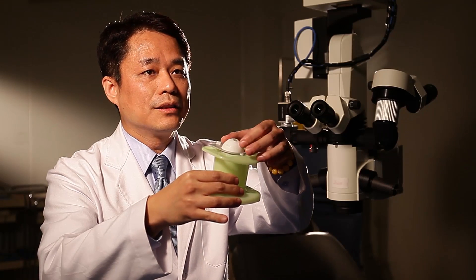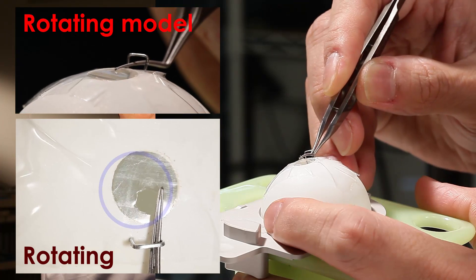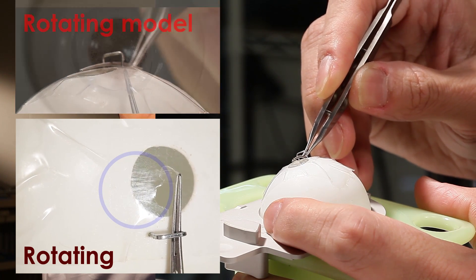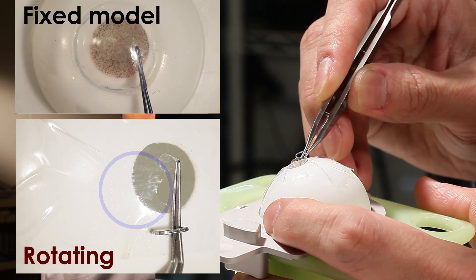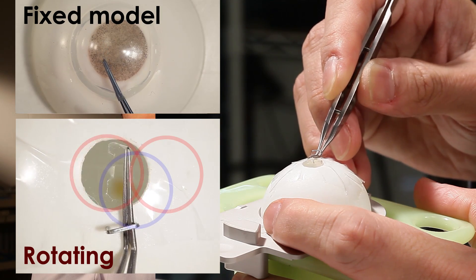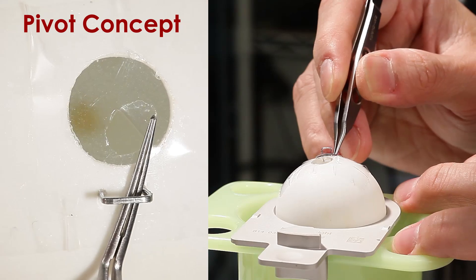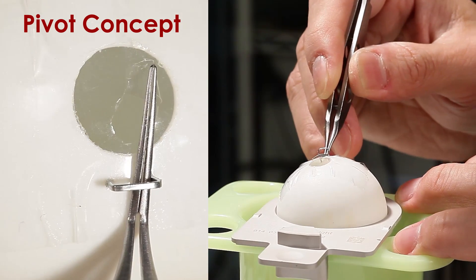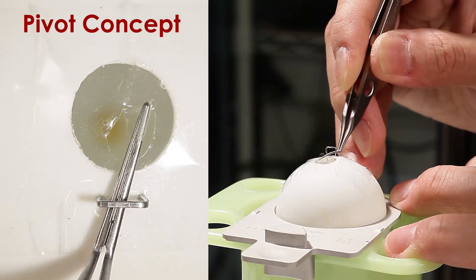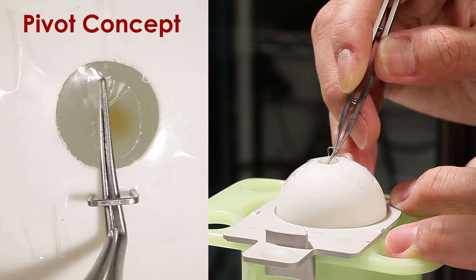Now you've got your very own rotatable eye model. This freely rotatable eye model not only simulates the movement of the eyeball while receiving force, which cannot be reflected by artificial or porcine eyes, but it can also provide an easy, cheap, and repeatable way for young surgeons to practice. After using the rotatable eye model, practice repeatedly. Although the pivot concept is difficult, the young surgeon can finally realize what it means.